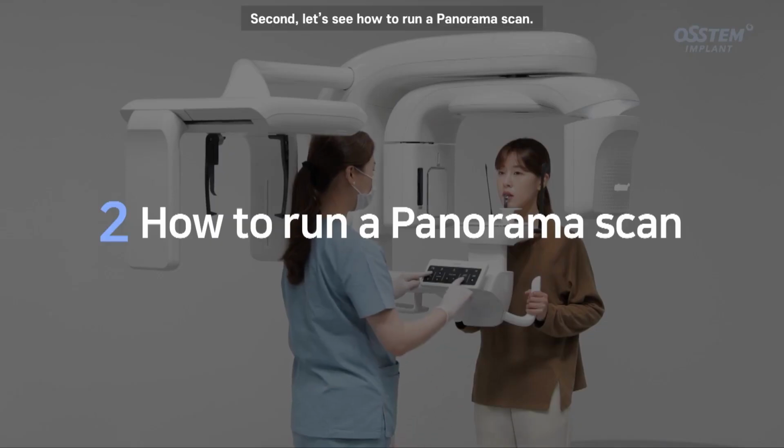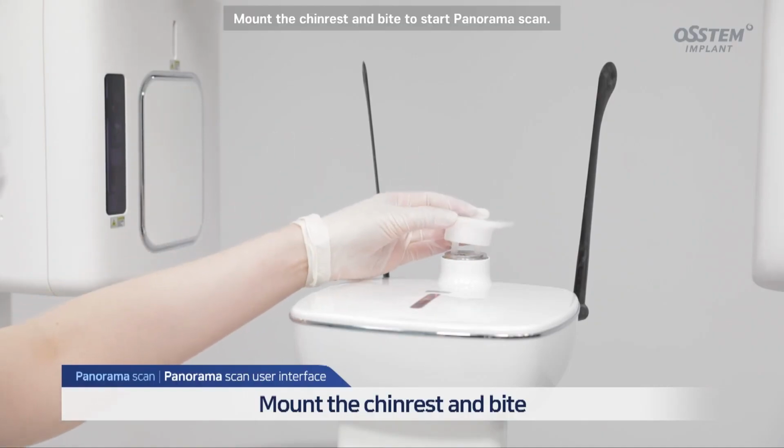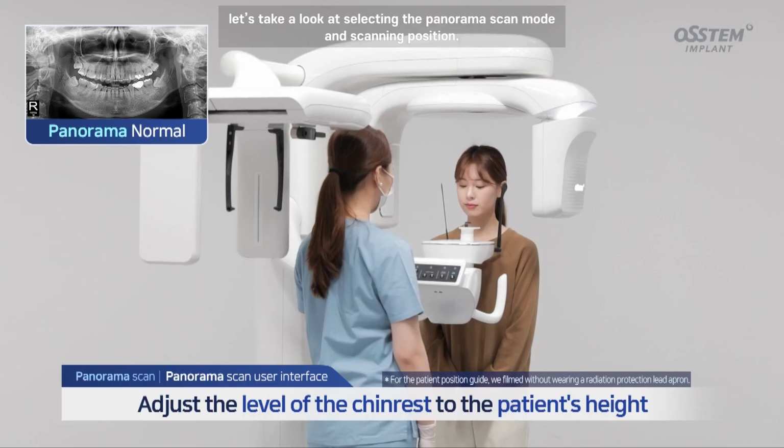Second, let's see how to run a panorama scan. Mount the chin rest and bite to start panorama scan. Let's take a look at selecting the panorama scan mode and scanning position.